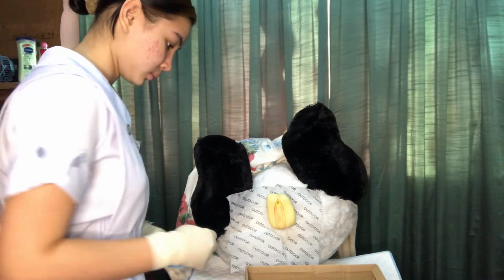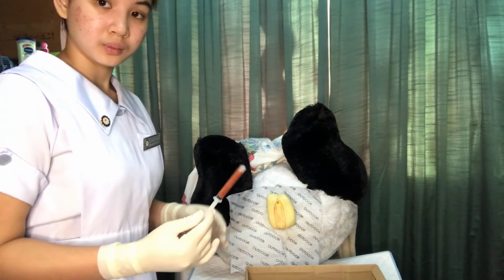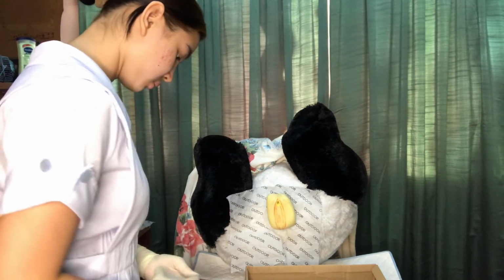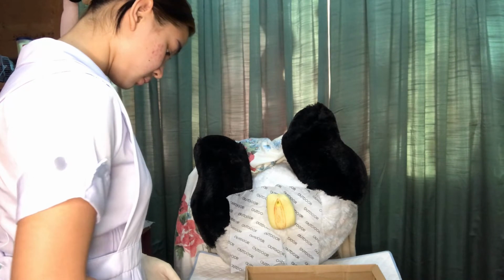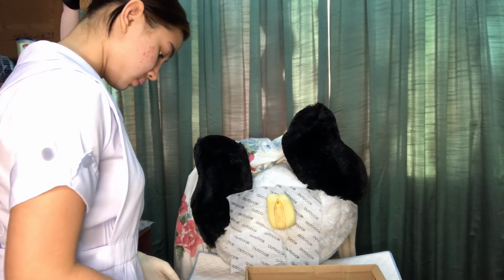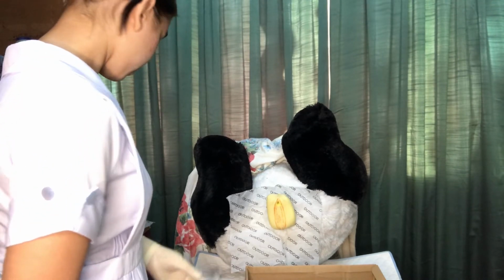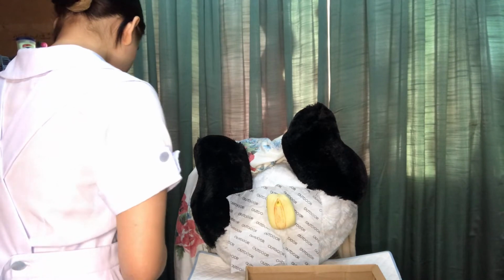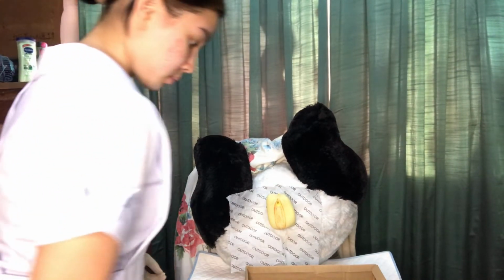I open the cotton balls, and I have here an improvised betadine, and I'm going to put it on the cotton balls to cleanse the urethral meatus. Make sure that you put on the sterile gloves. This is an aseptic method, and we're going to touch the genitals.